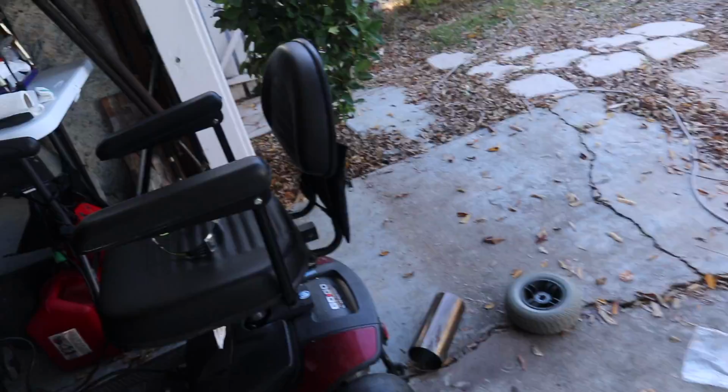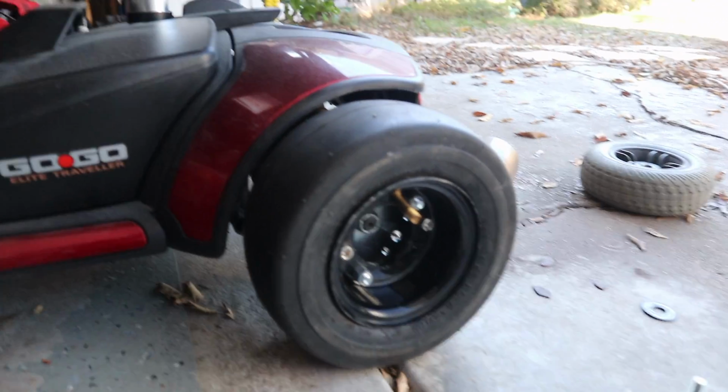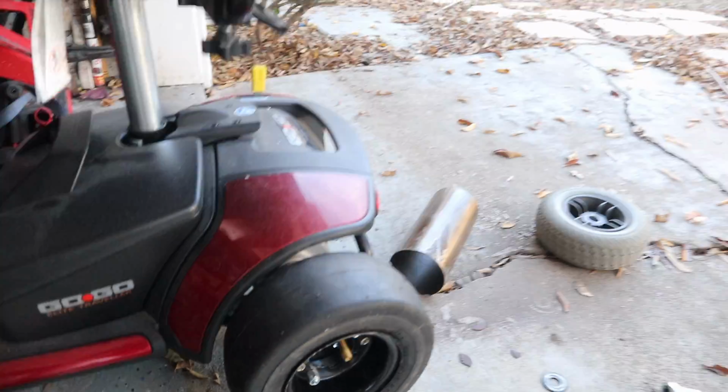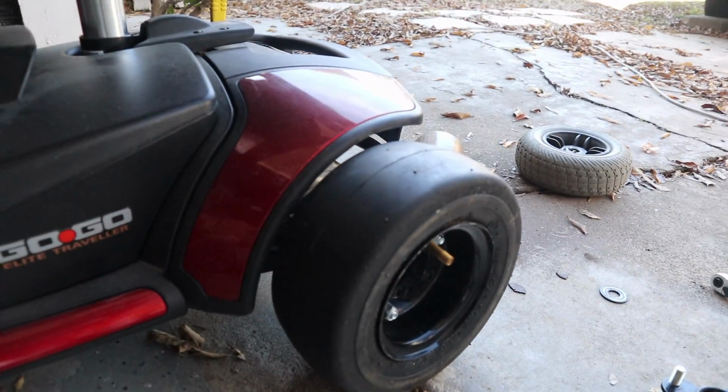Out of all honesty, taking the time to measure everything and make sure I had all the right bolt sizes and hub sizes really did make the difference for how this came out, which is so crazy. I'm going to end up doing the other side really soon, but I'm just taking a quick second to admire this, because I wanted to do this swap for a very long time, and I feel like there's no information about this kind of stuff. So I hope this video was very useful and informational for someone who's looking to do this swap.